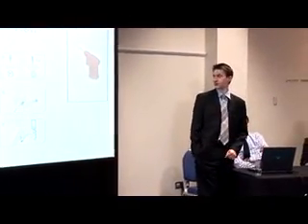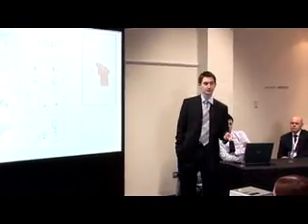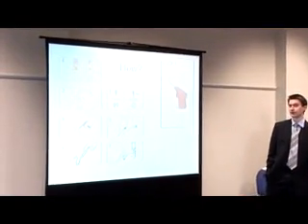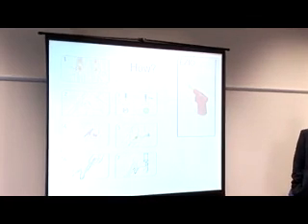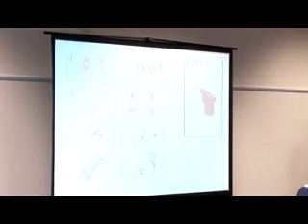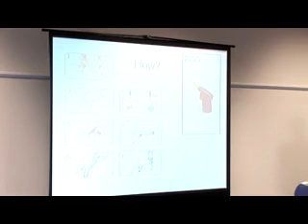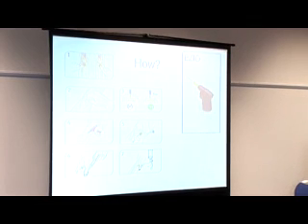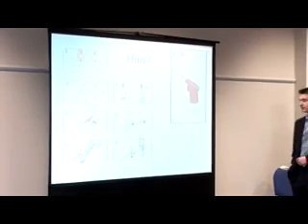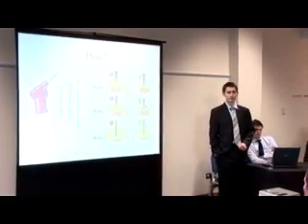So how do you do it? Well, we can play at the back, but you find your landmark, clean it. There are 3 needles to choose from, which I'll talk about in the next slide, but you check your correct depth. You drill in at 90 degrees to the bone. Once it's in, you take off the inner part. You connect it up to some tubing, which you should have flushed already with some saline. And then you inject in under pressure, all right? So it's usually in a pressure bag. The depth gauge part is quite straightforward.